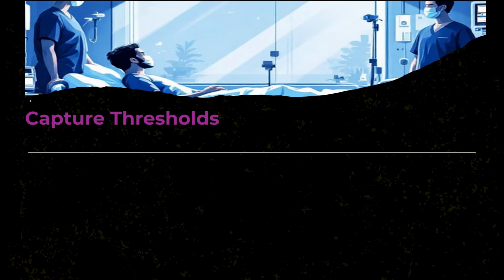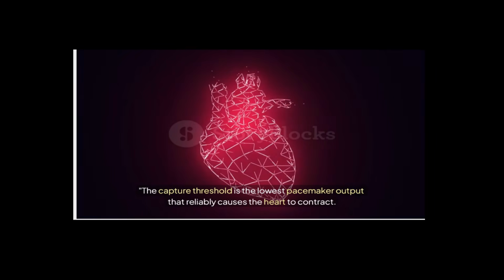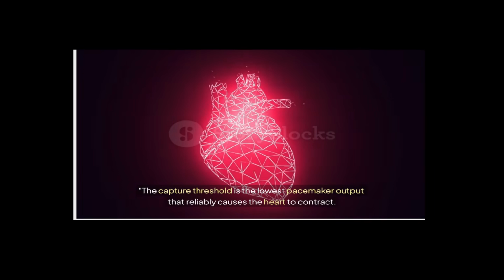The second part to be checked during the daily checking is capture threshold. It is changeable in patients who are on pacemaker due to changes in the electrolytes, maybe changes in acidosis, hypoxia. All of these can change the threshold daily and should be checked daily. What's meant by capture threshold? It is the lowest pacemaker output that can cause the heart to contract.